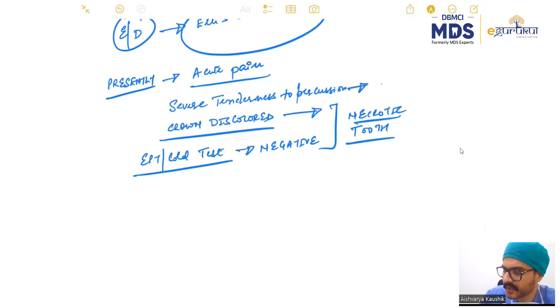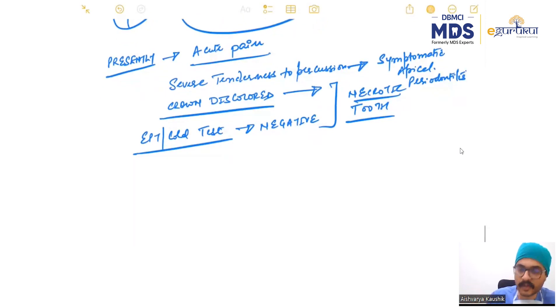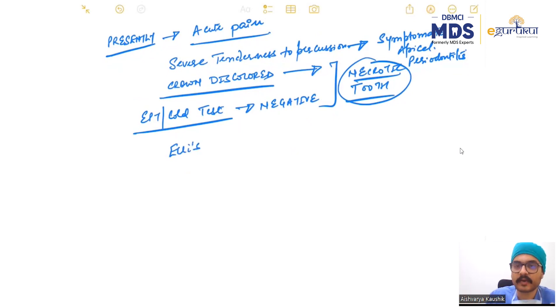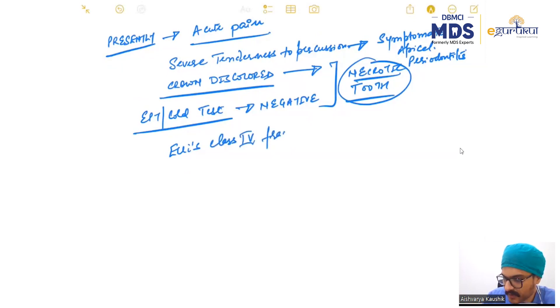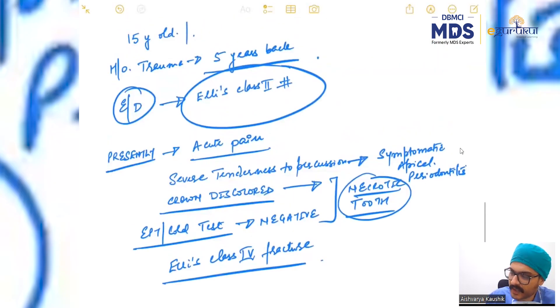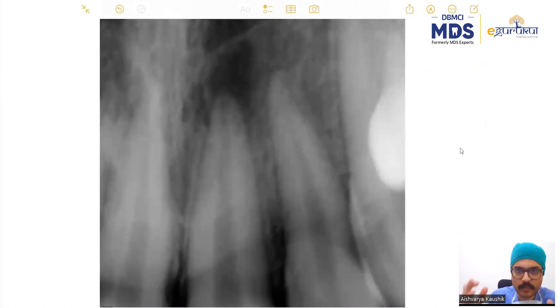Second, there is severe tenderness on percussion, so there is a symptomatic apical periodontitis. Next, because the tooth is necrotic and has sustained trauma, we did access cavity preparation, and the moment we opened the access cavity, there was frank discharge of pus.